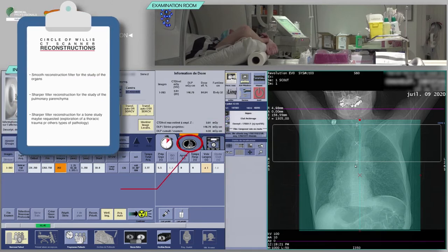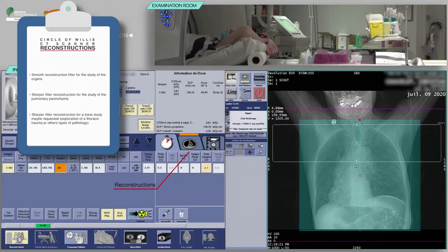Check the reconstruction boxes. For the acquisition of a chest scan, you will need at least a reconstruction with a smooth filter for the study of the organs and a reconstruction with a sharper filter for the study of the pulmonary parenchyma. A reconstruction with a sharper filter for a bone study may be requested as part of the exploration of a thoracic trauma or other types of pathology.